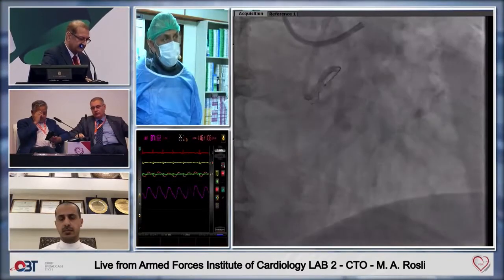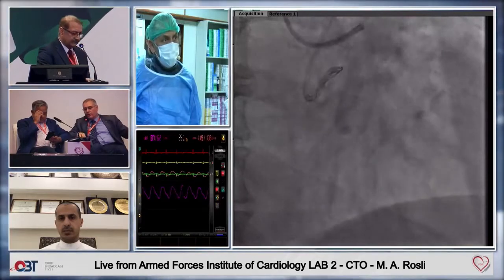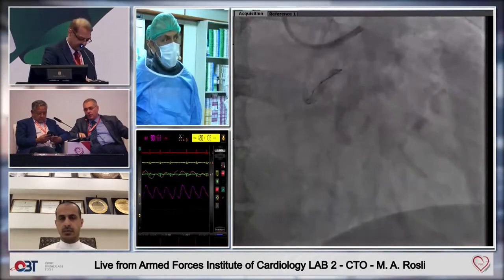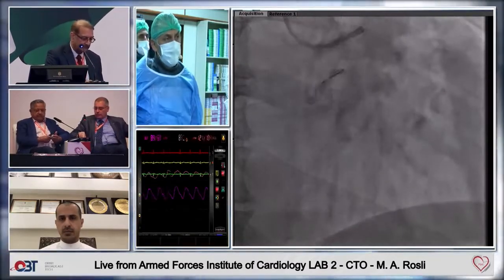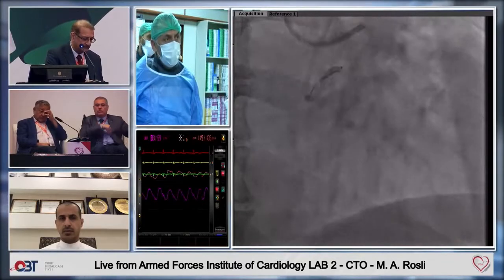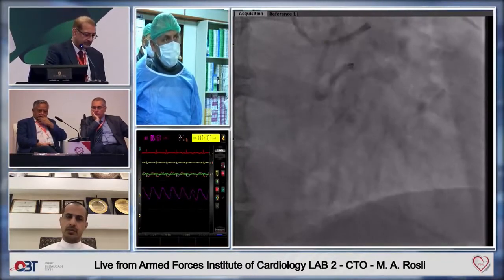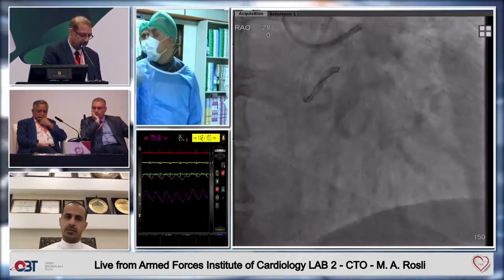Let's try a little bit. Ömer abi, what will be your second choice and third choice? Wire choices, wire escalation. But it will be Gaia Second, or it could be Judo Trigram as a next. So let's have, you don't have that much time, right? I'd like to have Gaia Second. Gaia Second, please.